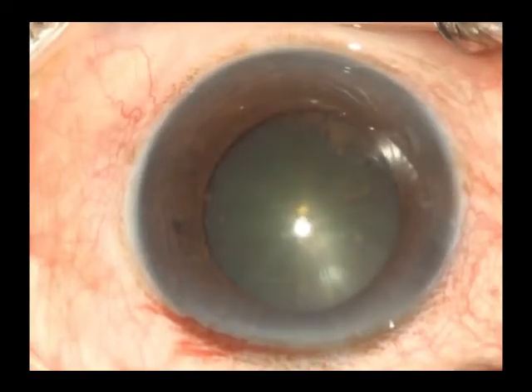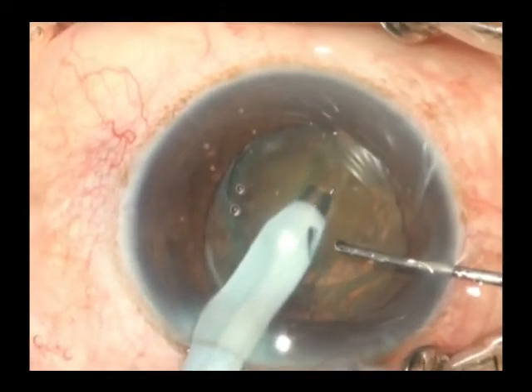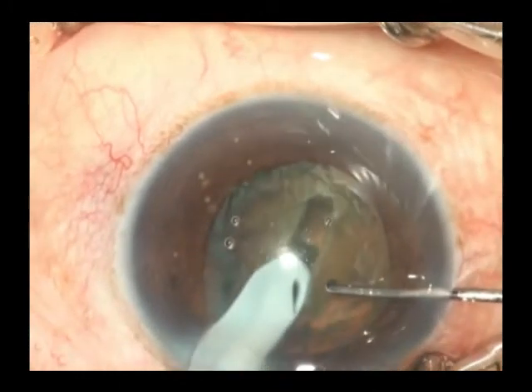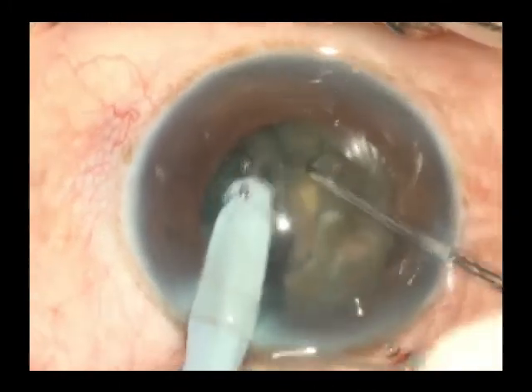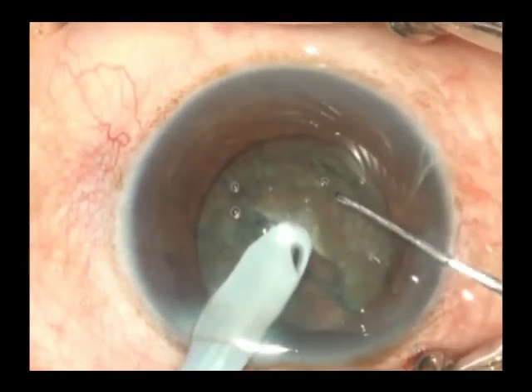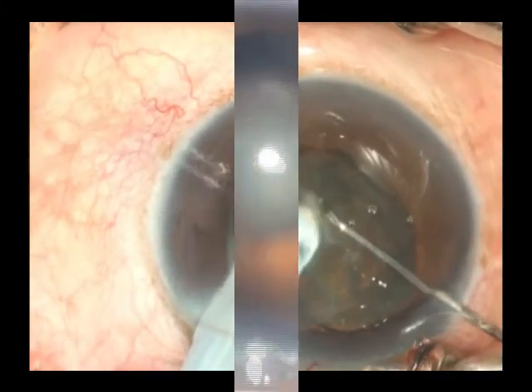The other technique of managing a soft cataract is by performing a stop and chop. In this technique, a groove is made from one end to the other of the heminucleus down at center to a depth of almost 90%, after which two instruments are used to bisect the nucleus into two heminuclei, after which each heminucleus is subsequently downsized and emulsified.